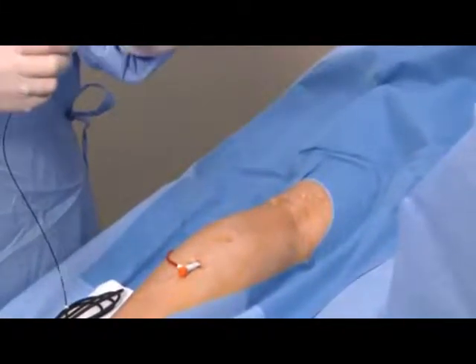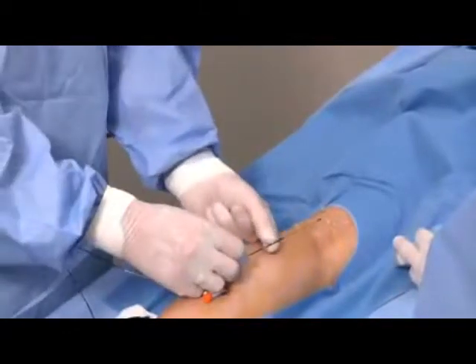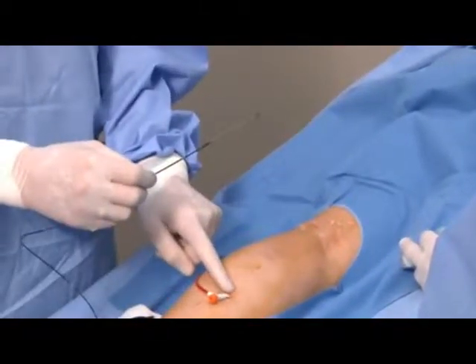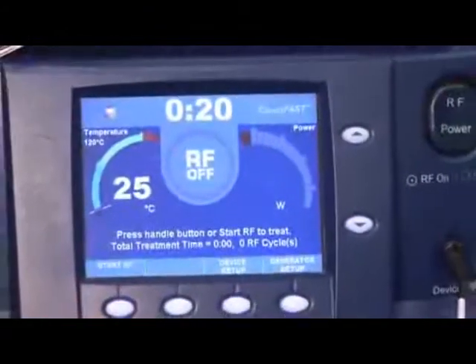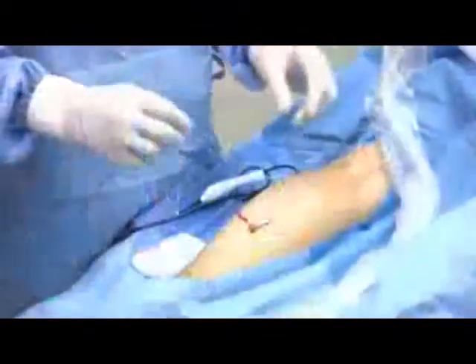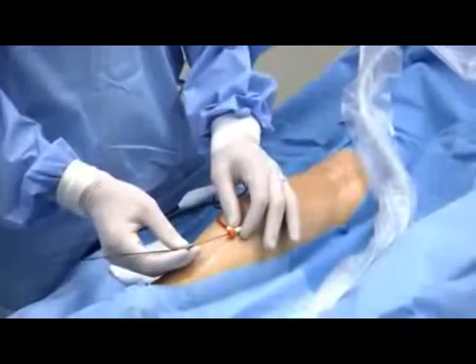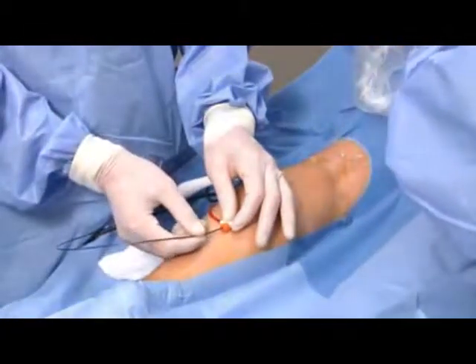And then, in a stepwise fashion as we apply energy, we will march this catheter back in several steps to the entry point in the back of the leg. This is the instrument that generates the microwave or radiofrequency energy that we use during ablation. The next step is to advance this catheter to the appropriate location in the back of the leg.